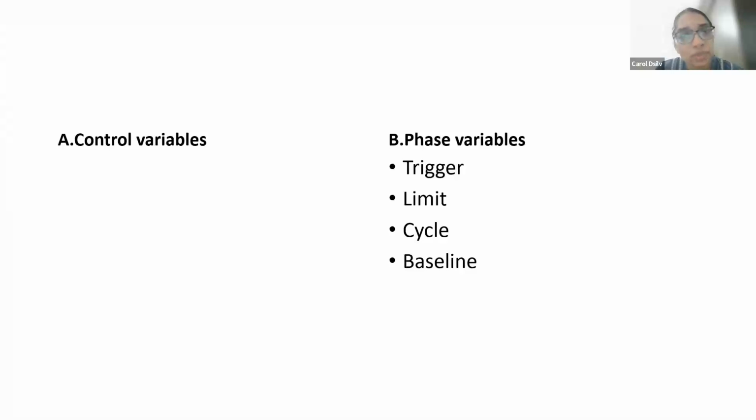And if it's patient triggered, what are the common triggers we have? Pressure and flow triggers. Very good. If it's a patient triggered breath, it will be either a negative deflection, that's your pressure triggered, or a flow triggered, depending on what you set. As an operator, you will also set something called a trigger sensitivity. What is the limit variable commonly?